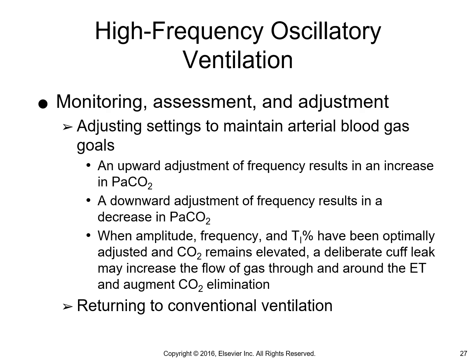So different monitoring, assessment, and adjustment, just kind of recapping a couple things here. Again, an upward adjustment in the frequency is going to result in an increase in your PaCO2, okay, because you're going to have a smaller volume displacement. And then a downward adjustment in the frequency is going to result in a decreased PaCO2.